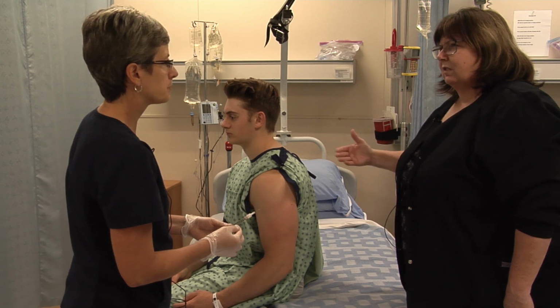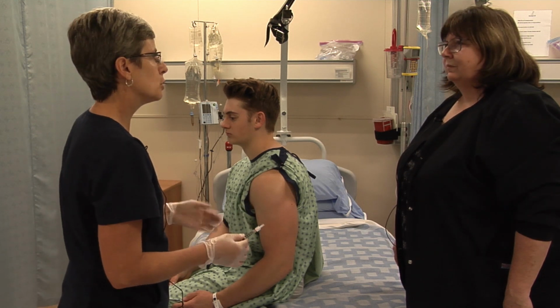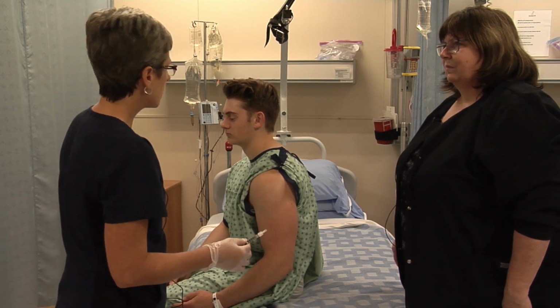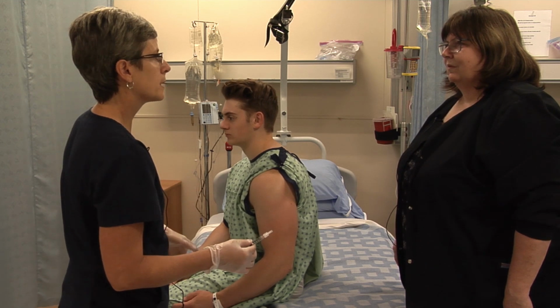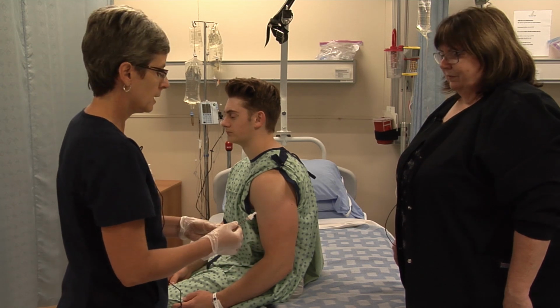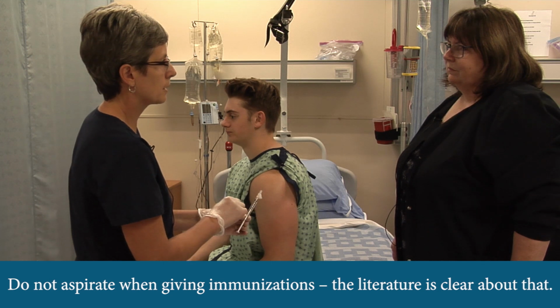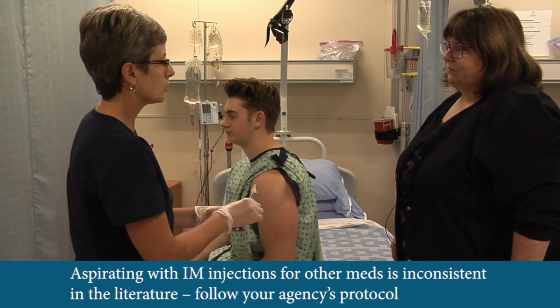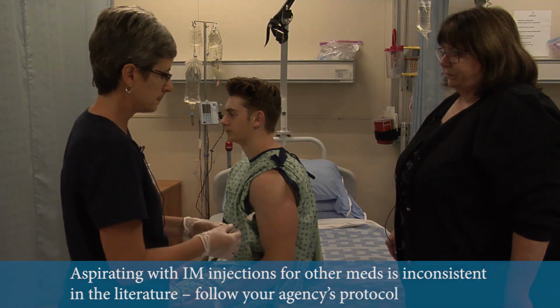What if the patient says, oh, ow, ow, ow? Then slow down. And you can use distraction techniques like tap your foot on the floor, or start singing a song, or wiggle the fingers on your other hand, something just to get their mind off. The other thing is if we aspirate and we get blood, because that's part of the risk with IM injections, we need to remove the needle and start the whole process again.